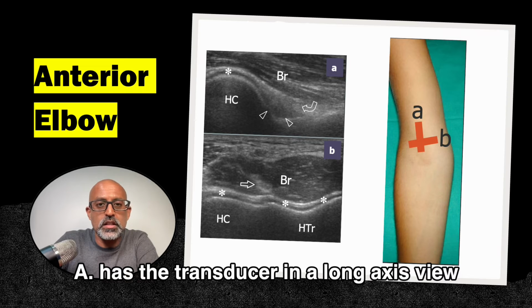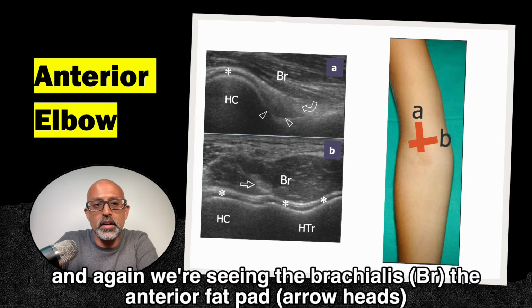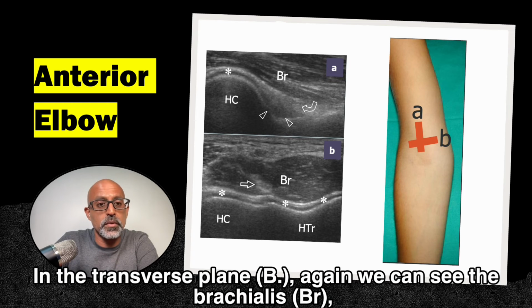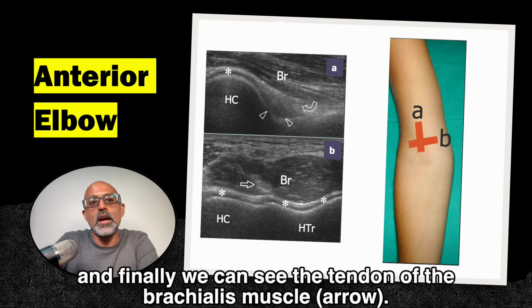Image A has the transducer in a long axis view, and again we're seeing the brachialis, the anterior fat pad, and the cartilage sitting over the humeral capitellum. In the transverse plane, again, we can see the brachialis. We can see the cartilage over the humeral capitellum and trochlea. And finally, we can see the tendon of the brachialis muscle.